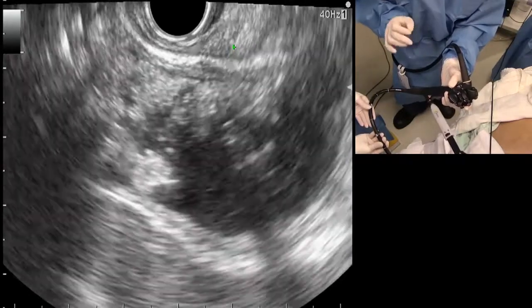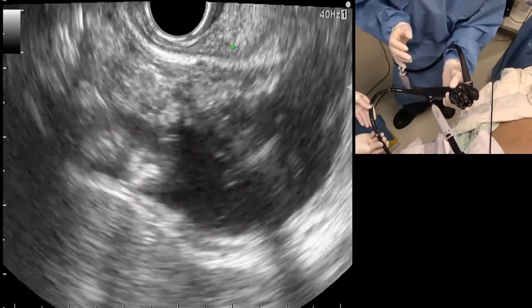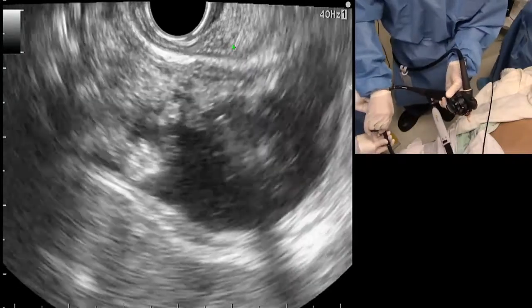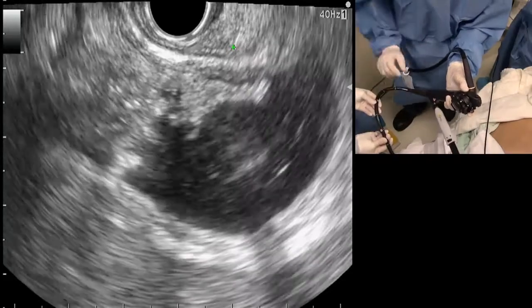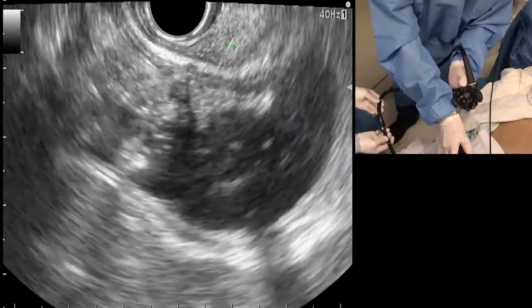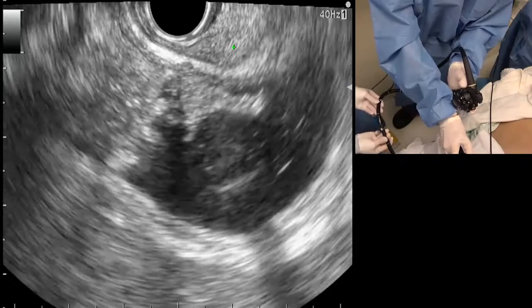So it provides a maximum cutting effect without cooking the tissue too much. So you need that cautery to get through, but you don't want to cook the tissue, and you want to get in as if you were using a scalpel. So I think we're about ready to go now. I'm just going to make sure that the pressure looks good. And I'm going to press on the pedal, and I'm going to hold it there just for a quick second and then advance in, okay?